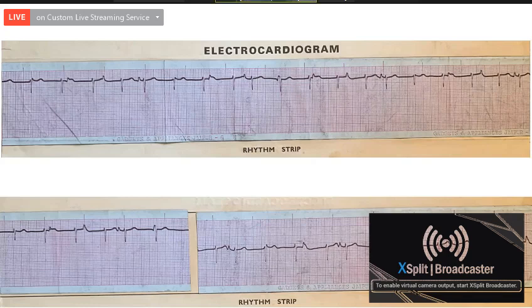Whenever the atrial rate is less than the ventricular rate, you consider it as an abnormality in impulse formation. If the atrial rate is more than the ventricular rate, that is an abnormality in impulse conduction. So here the atrial rate is less than the ventricular rate, indicating that this is an abnormality in impulse formation.